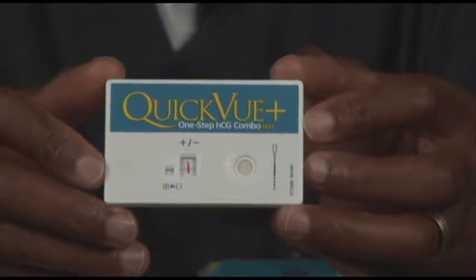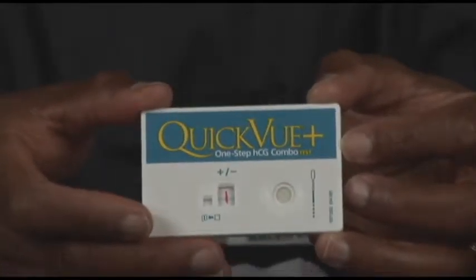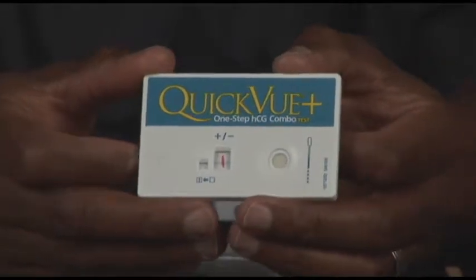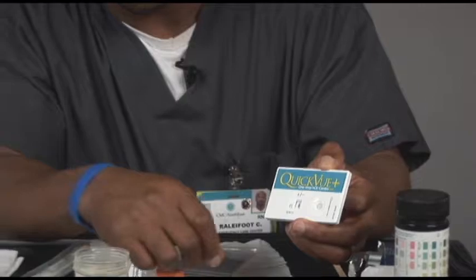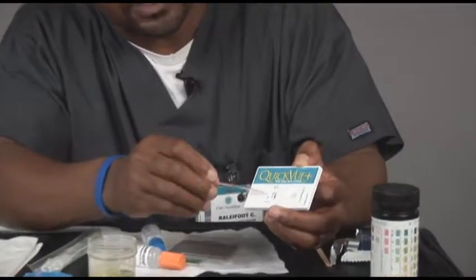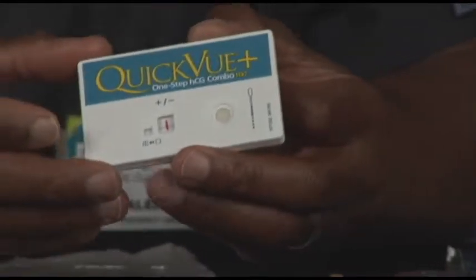A positive result would look like that. You see we've got the pink line down the center, which would be your positive indication. Like I said, it may not look that pretty. And you should also get a blue line in the center of your control box, and that indicates that your card is a good card.